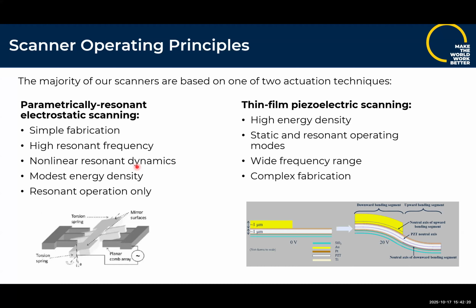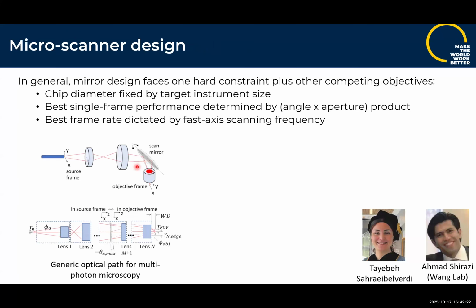And so if we are trying to set up a new scanner for a new endoscopy system, we basically have to balance the limitations and capabilities of the scanner with what the optical system needs to provide a useful image for some clinical or scientific task.